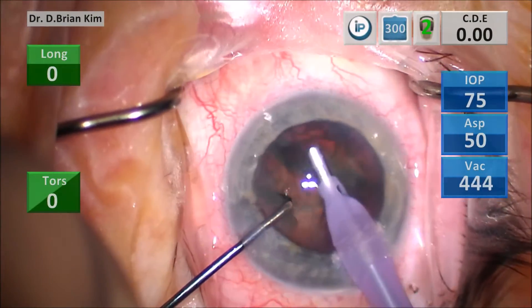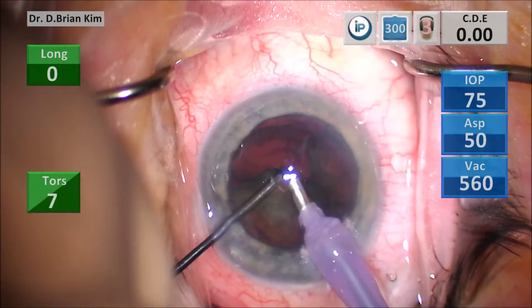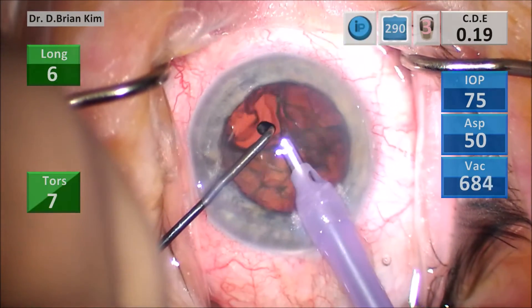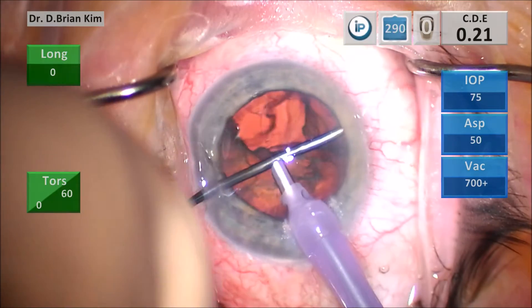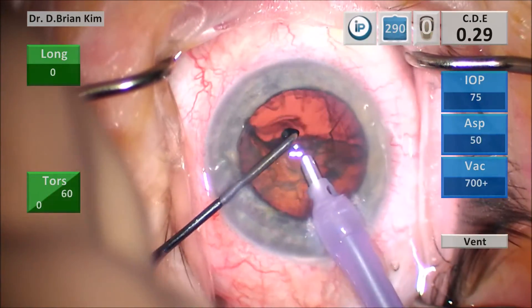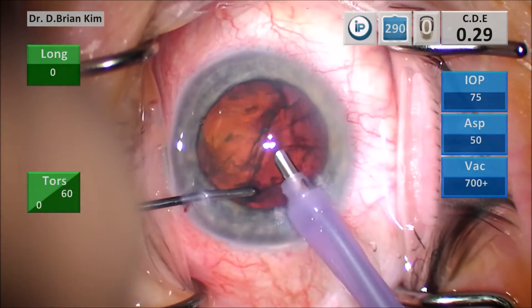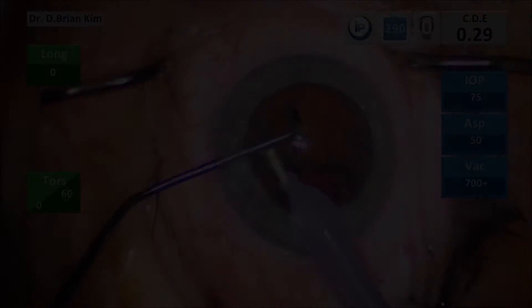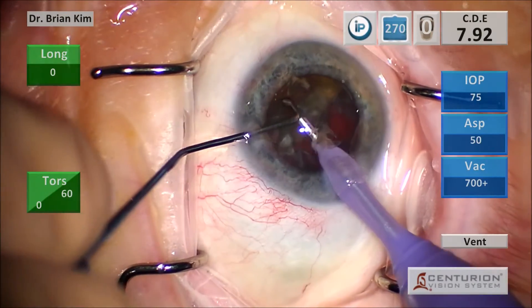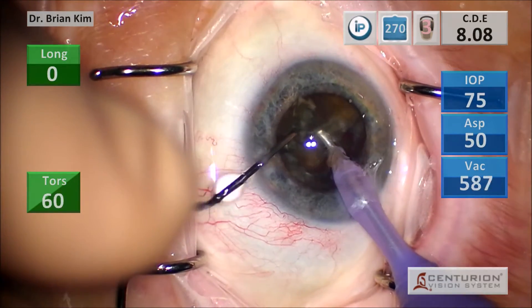After cross chop, I'm trying to grab the first quadrant but it's stuck and won't come forward. I use the chopper to pull the fragment centrally. Some chopping surgeons like to aggressively crack the pieces, but I really think that's unnecessary. As long as you do this maneuver, you can be confident you'll be able to mobilize that first quadrant.